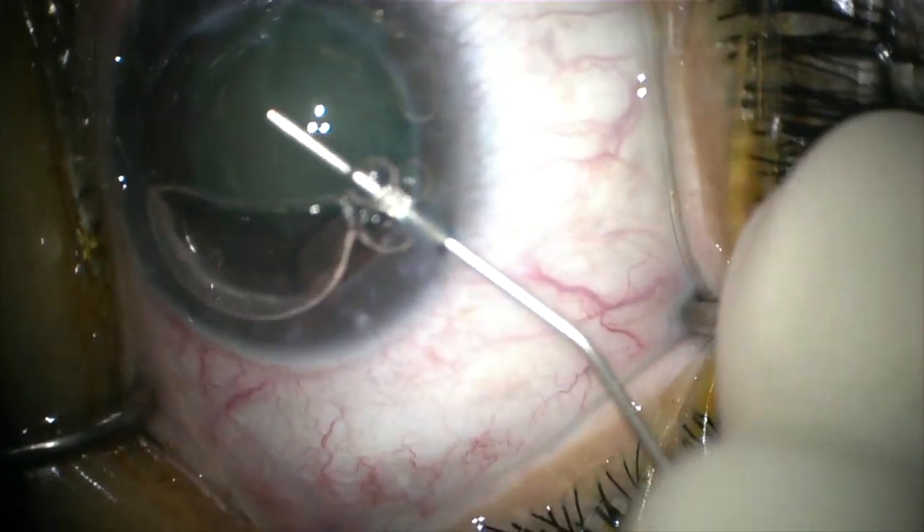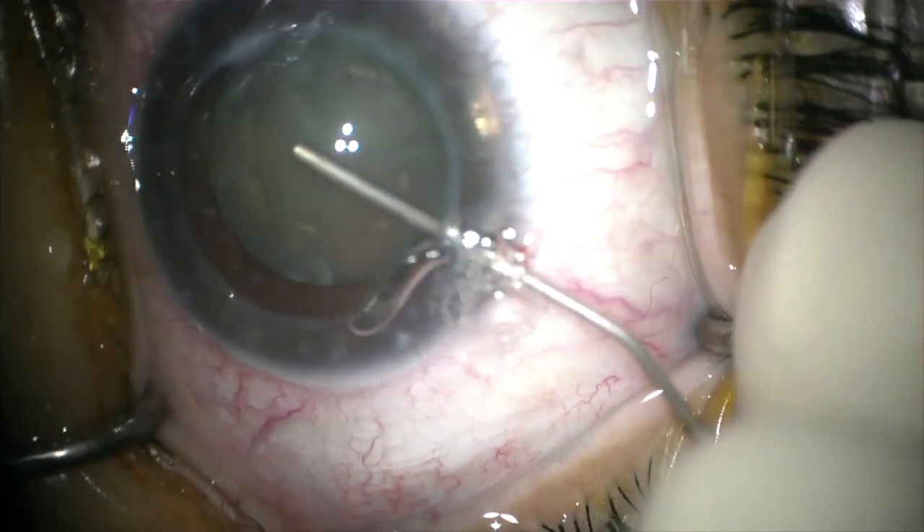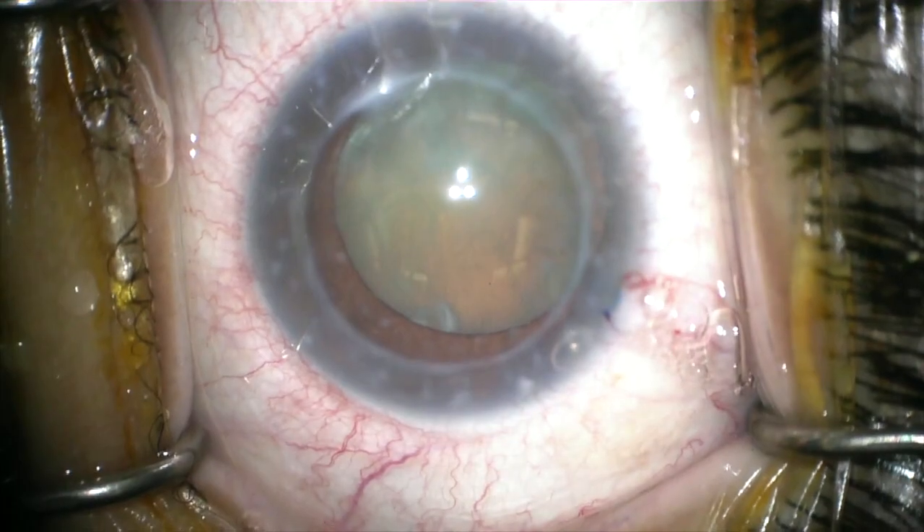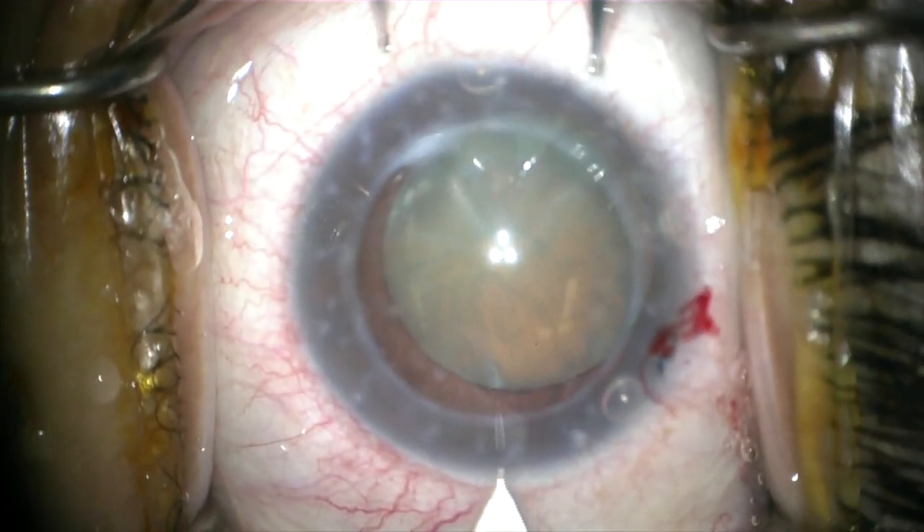I also like to use a dispersive viscoelastic to protect the corneal endothelium. This is extremely important, and don't be afraid to replace the viscoelastic if needed at regular intervals during the surgery.